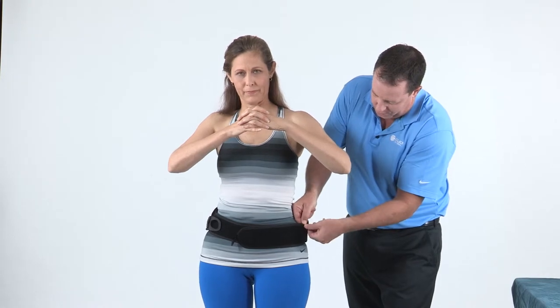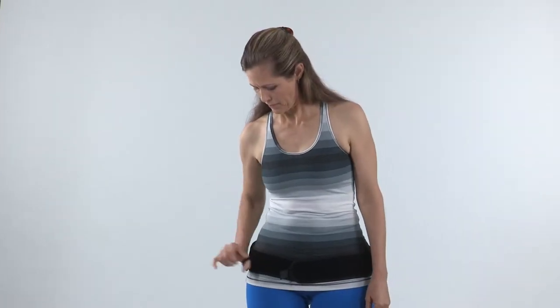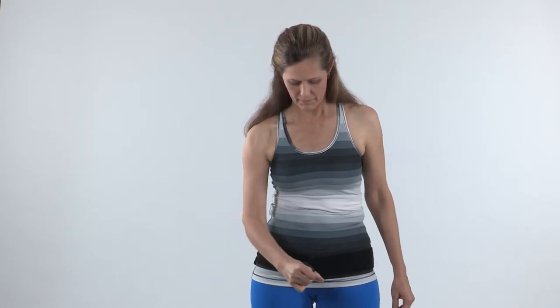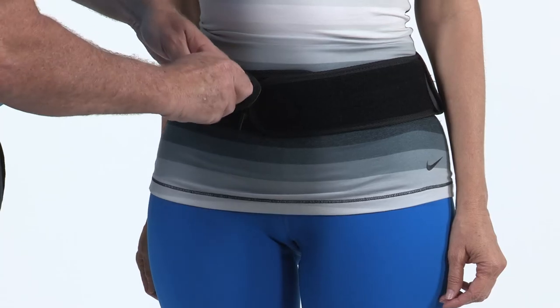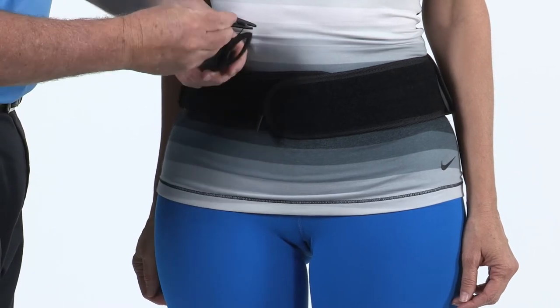The brace should fit fairly snug to the patient at this point. To tighten the belt, instruct the patient to remove the hook pull tab, extend out, and wrap to desired compression. Attach the pull tab to the front of the brace, making sure that the tab crosses the hook closure. The length of the pull tab may be adjusted by removing the lace spool from the pull tab pocket and winding or unwinding lace.